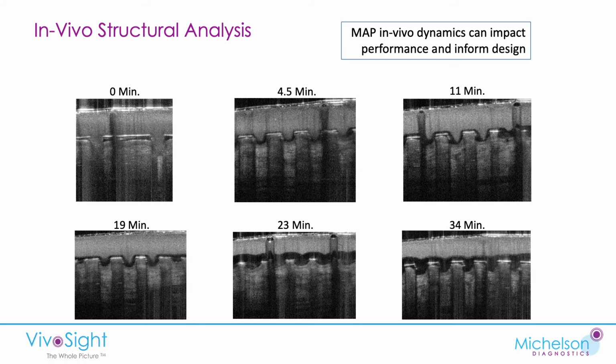So this really means that OCT gives you a way to actually measure and monitor the morphology of microneedles post-insertion. It gives you a way to look at how that can be affected by materials, spacing of microneedles, length of microneedles, and so forth, and make rapid progress on optimizing the design of your microneedle arrays.